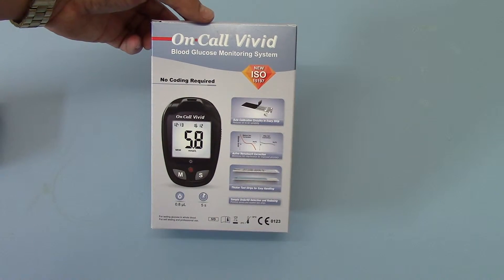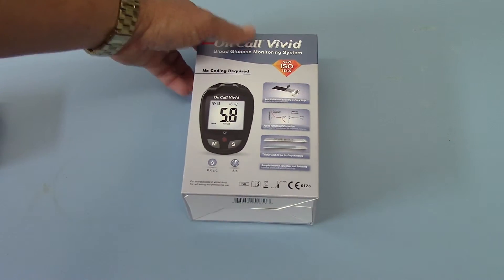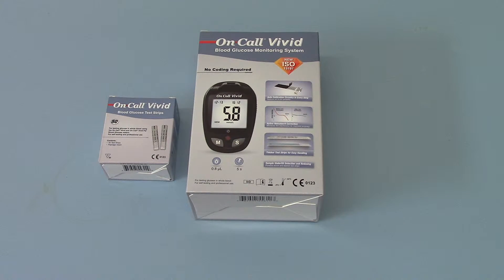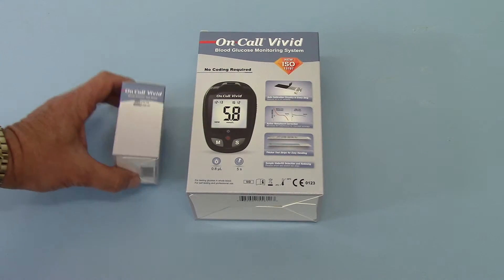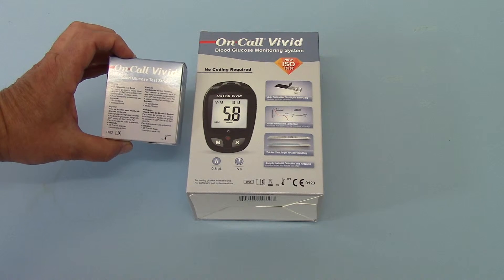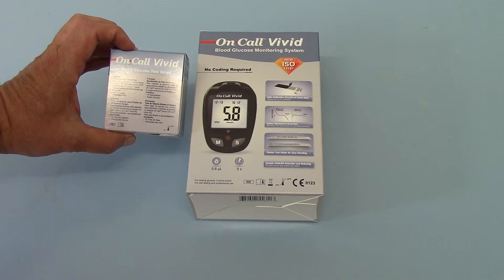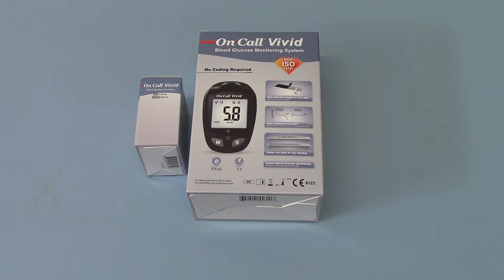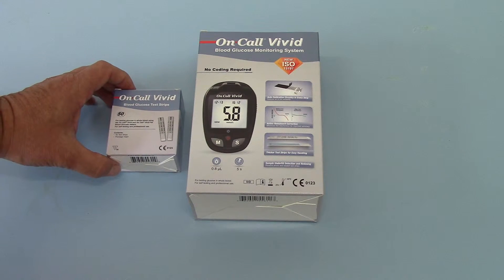The 10 included test strips will get you started, but additionally in the UK we sell the OnCall Vivid test strips, which are the only test strips that can be used in this meter. So if you buy the meter you commit to buying ongoing supplies of the OnCall Vivid brand test strips. These are supplied in packs of 50, with each pack containing two vials of 25 test strips. The idea is that you work through the first vial and only open the second vial — breaking the seal — when you begin testing with the second 25.